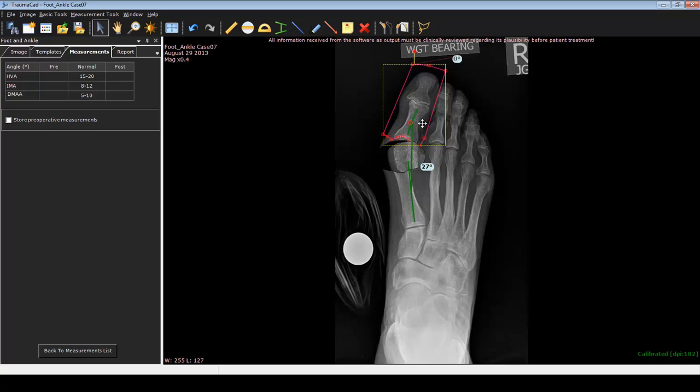The hallux, obviously, if you try to rotate it, does not rotate around this point or this bullseye. So we have to pick a point where this can rotate around. And as you know, since the proximal phalanx articulates with the head of the first metatarsal, the best point to choose would be right about the center of that head of that first metatarsal.